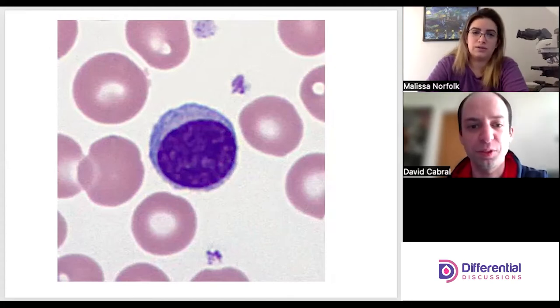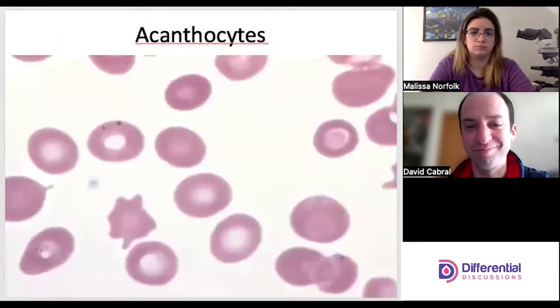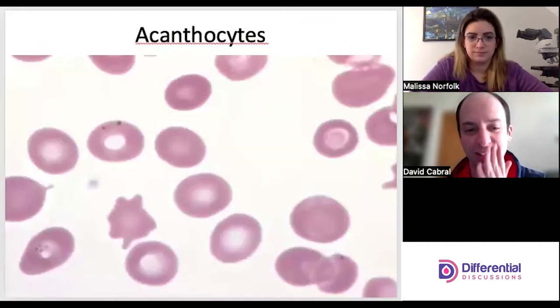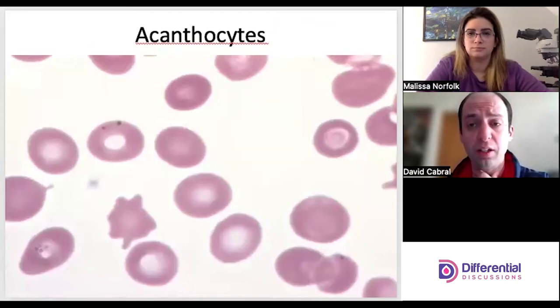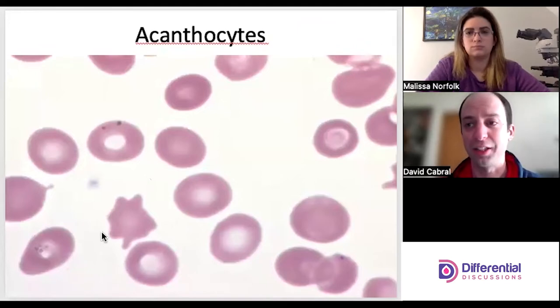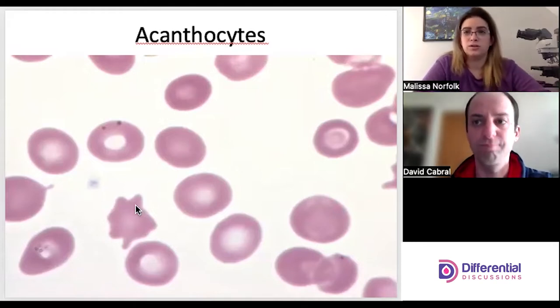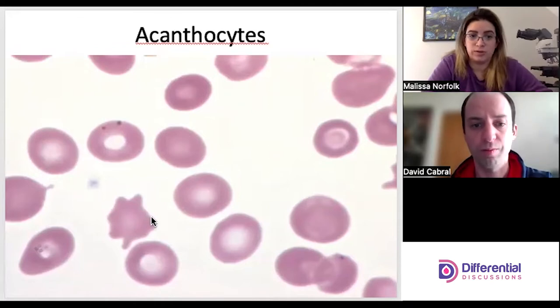Now that we've taken a look at normal red cells, let's look at some of the abnormal shapes — the fun stuff. Acanthocytes have uneven projections — they're commonly confused with echinocytes, which we'll get to later. Acanthocytes have uneven projections all the way around; some are larger, some are wider, some are really small, and some areas are completely flat. Pretty classic acanthocytes.